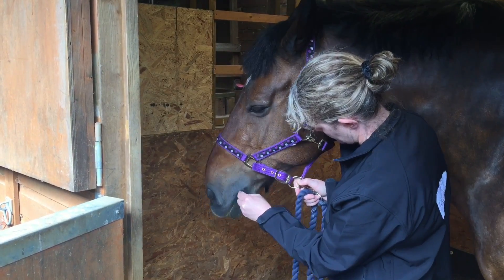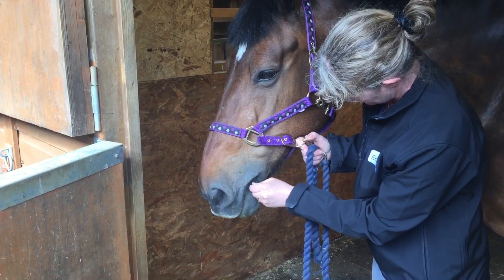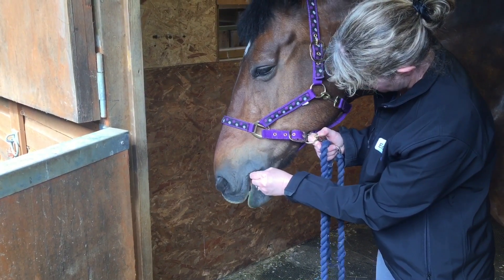A few horses will try to pull the swab back with their tongue to bite it. In these cases it can be useful to keep the swab moving gently back and forwards to prevent them from getting hold of it.